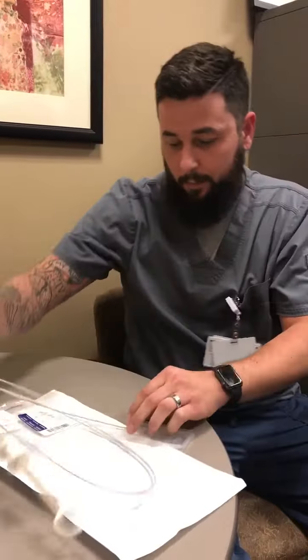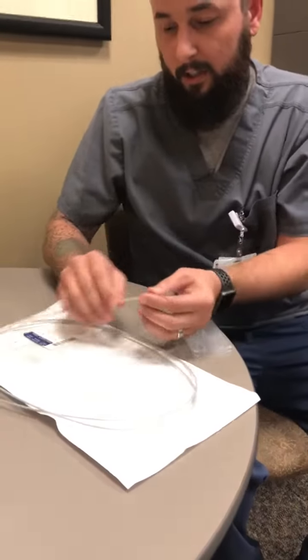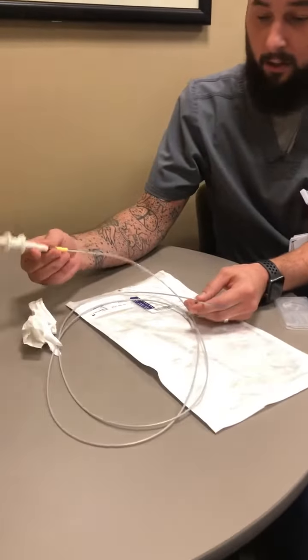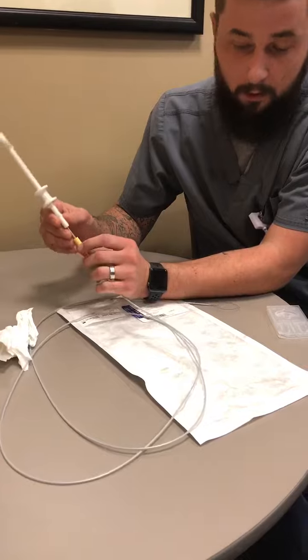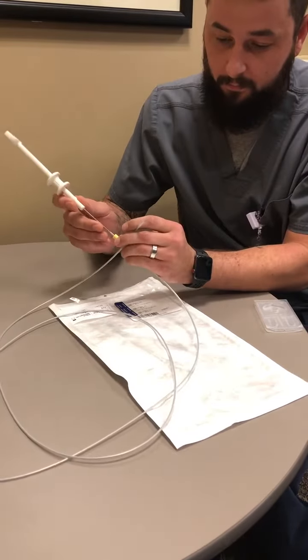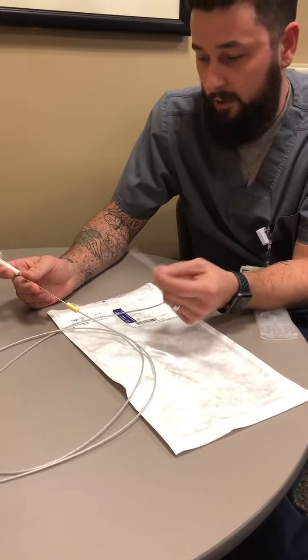When it comes out of the package, it's going to be already open. Once it is open and out of the plastic, you're going to pull your yellow stopper and close it. Once that is inside the sheath, you will give it to the doctor.